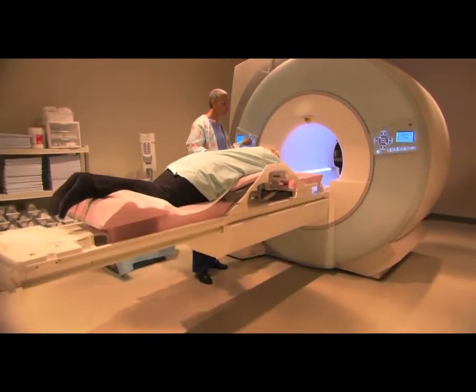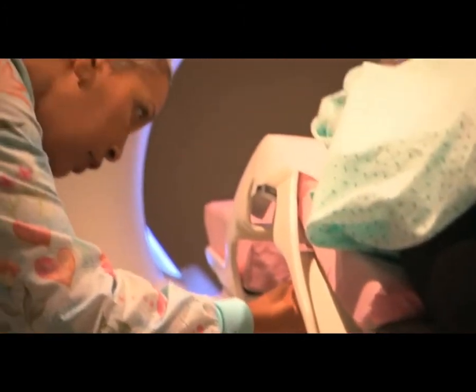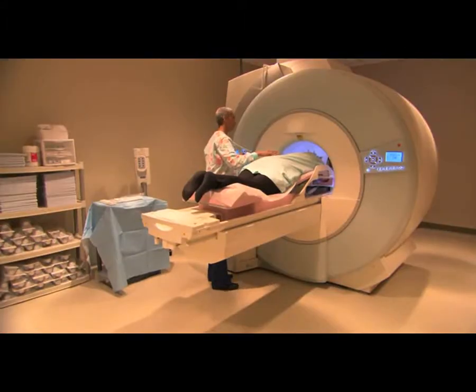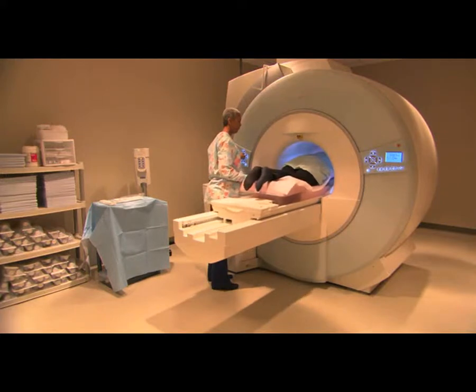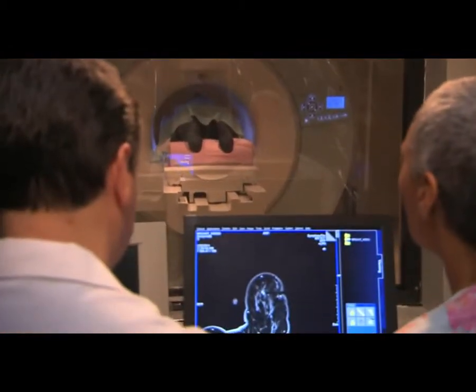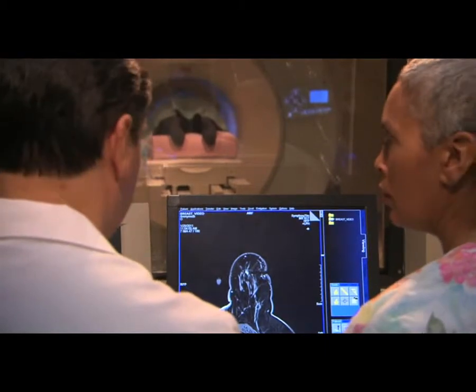The technologist will be in close contact with you the whole time. Once you're in position on the table, your technologist will very carefully position and compress your breast using the MRI compression coil. Next, she'll move you into the MRI magnet to take some preliminary targeting images.